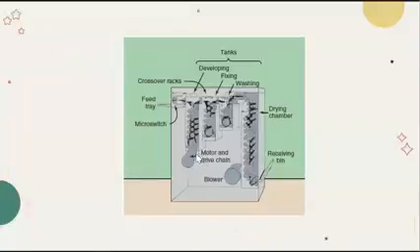So, as you can see, there are shallow tanks, each with their own processor transport rack. Some of them, which is the developer tank, has a deeper transport rack. Some processors have shallow washing tanks. So that means the deeper the tank, the more time the film is immersed in each tank. So if it is deep, the processing time is longer than in the shallow processing tanks.